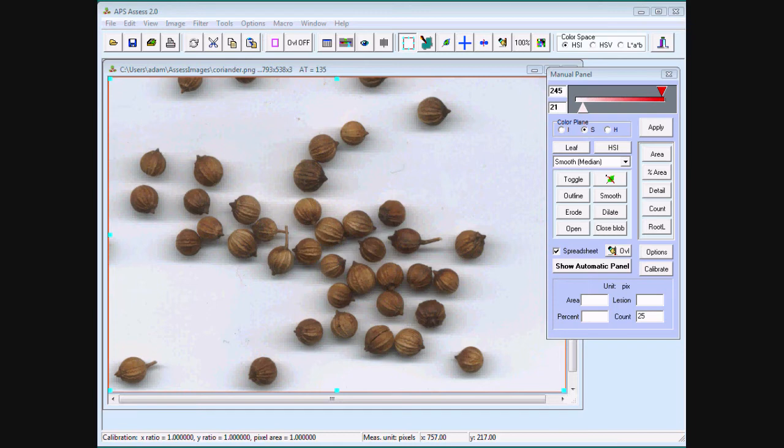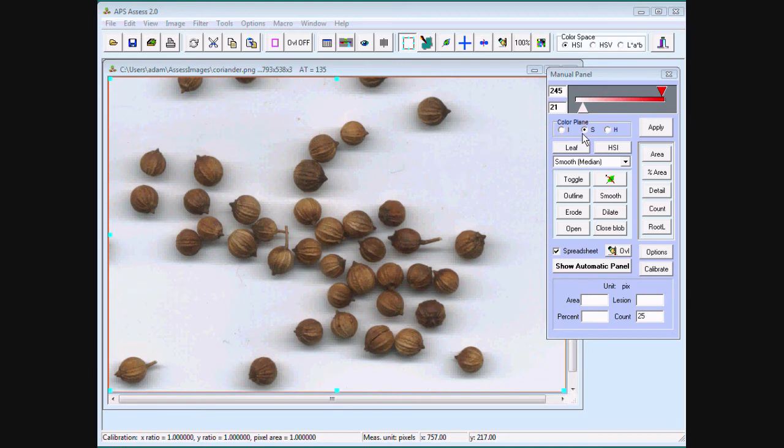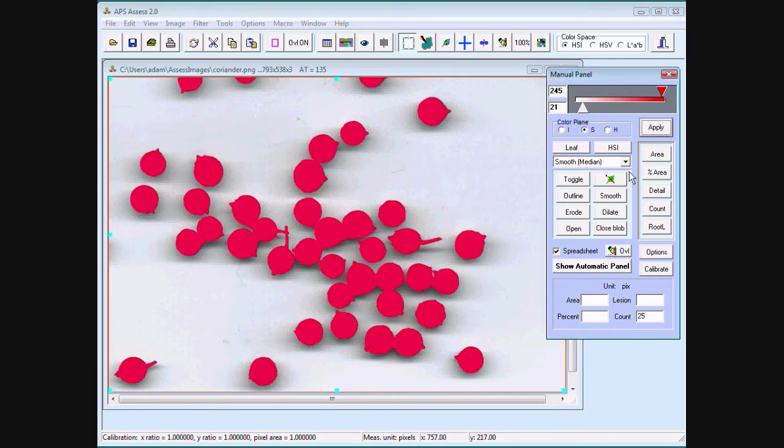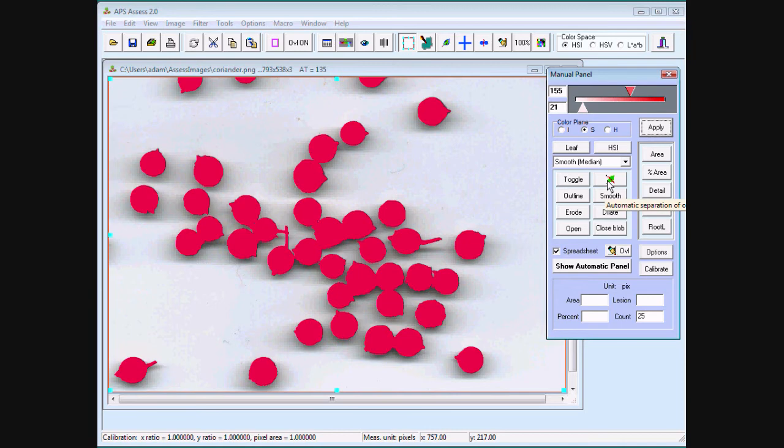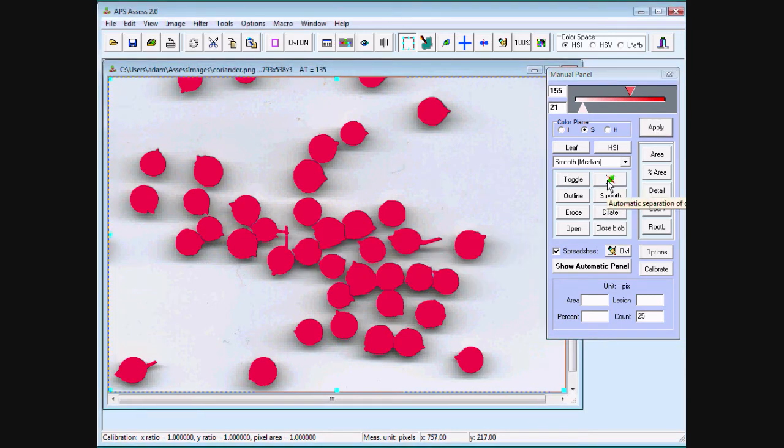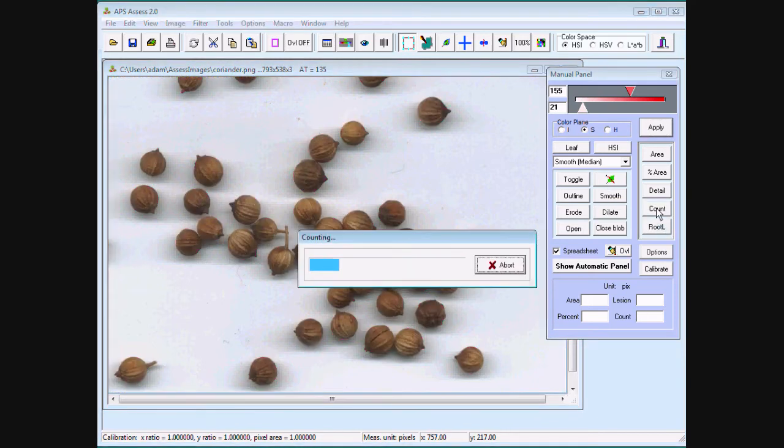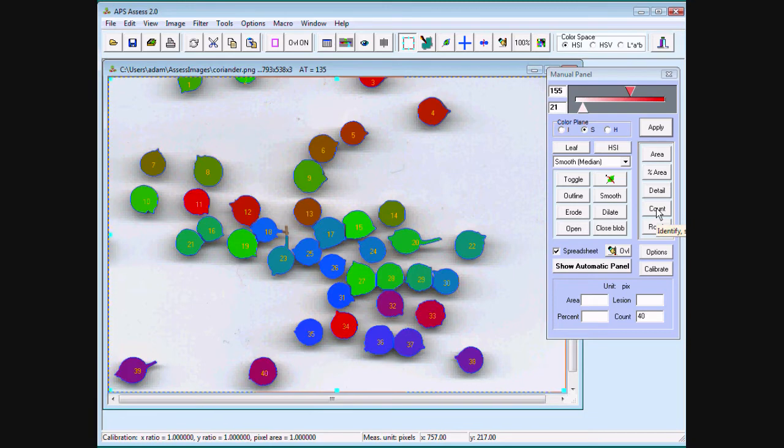If Assess can distinguish an object from its background, it can usually count it. In this example of coriander seed on a white background, I'm going to use the manual panel, the HSI color space, and because of the white background, I'm going to use saturation. Threshold the objects. Press an option called automatic separation of objects. This separates objects that are touching and simply press count. The objects are counted.